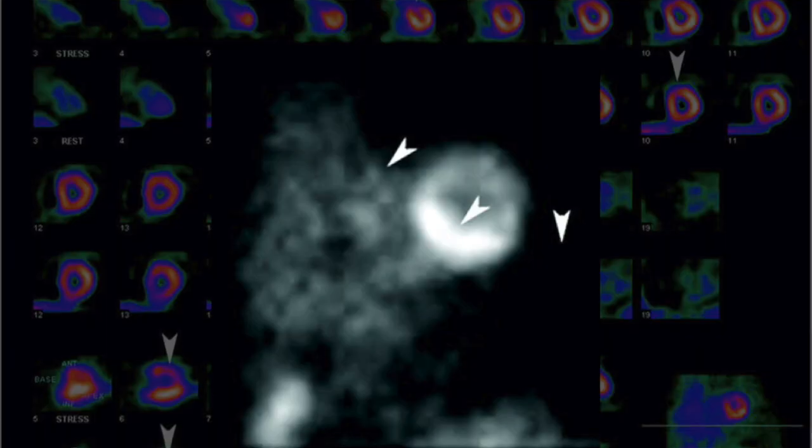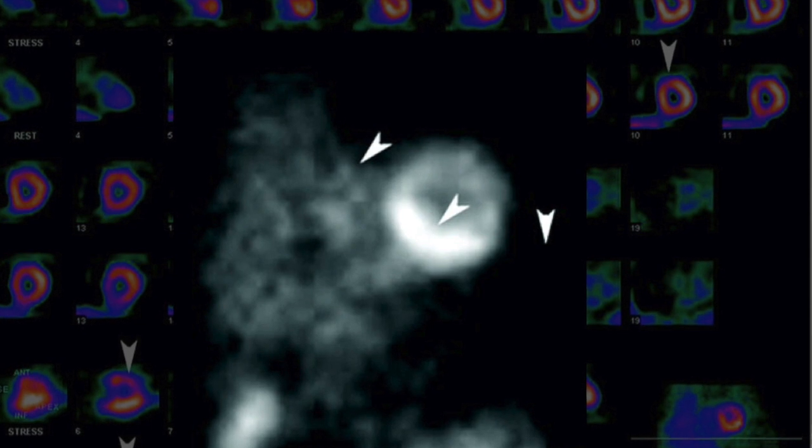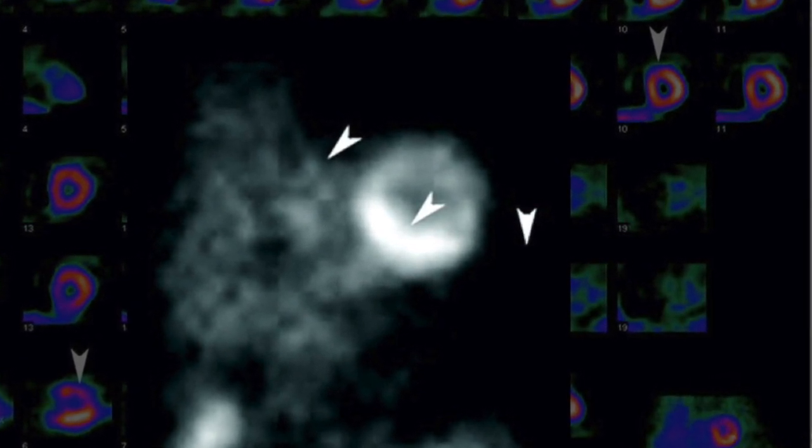But if we go back to the raw data, you can see that the arrowheads are pointing to this crescent-like reduction across the entire anterior wall of the heart, and that's due to breast attenuation artifact. Large-chested lady. It's a fixed perfusion defect anteriorly, not that of an infarction, but simply soft tissue breast attenuation in this case. So again, knowledge of the size and shape of your patient and review of the raw data will help you avoid miscalling this as a fixed defect, so a potential subendocardial infarction.